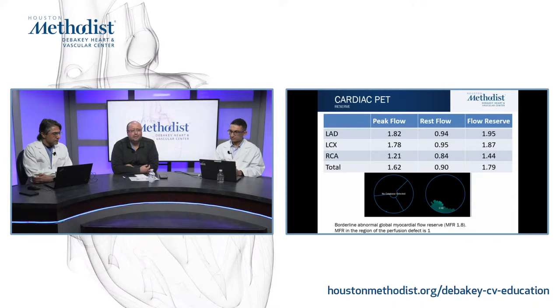And the long term prognosis of these patients is going to be determined by their atherosclerotic burden. Perfusion is going to help you to identify the cause of the symptoms and the amount of ischemia. And the amount of ischemia usually goes hand in hand with atherosclerotic burden, but it's not a one-to-one ratio.